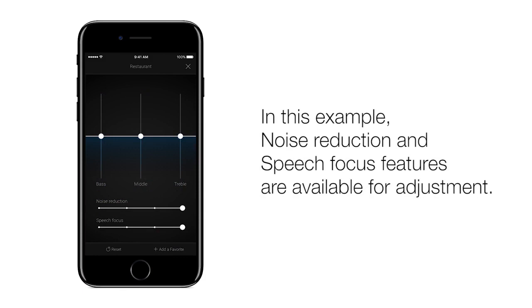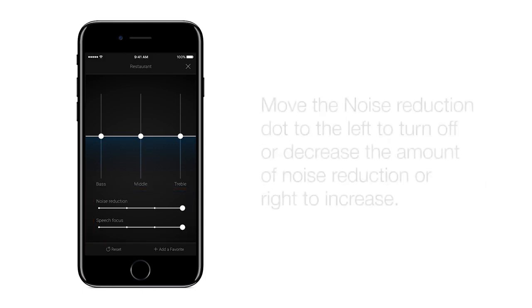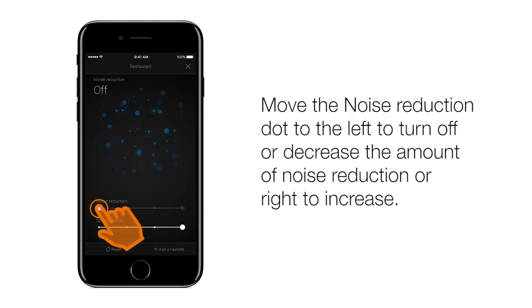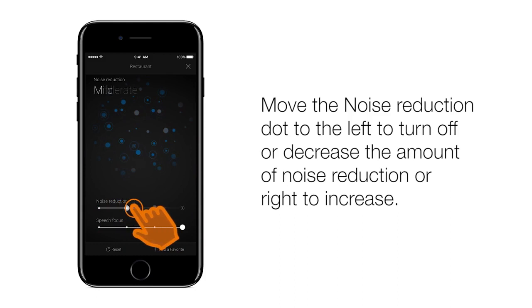In this example, noise reduction and speech focus features are available for adjustment. A box appears around the sliding scales at the bottom labeled Noise Reduction and Speech Focus. Move the noise reduction dot to the left to turn off or decrease the amount of noise reduction. Sliding it all the way to the left — the base, middle, and treble dots disappear. Noise reduction: off.